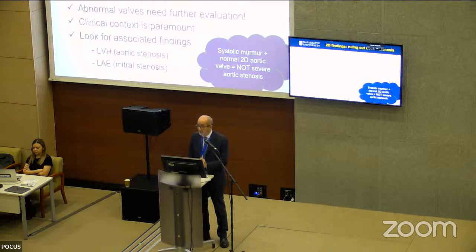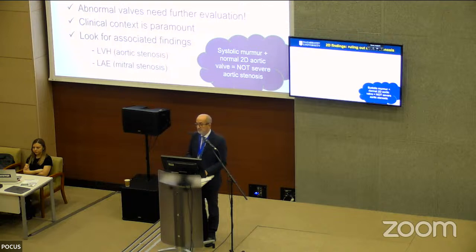Abnormal valves most likely need further evaluation for quantification. Clinical context, again, is important. And we can also look to associated abnormal findings, for example, LVH for aortic stenosis and left atrial enlargement for mitral stenosis.